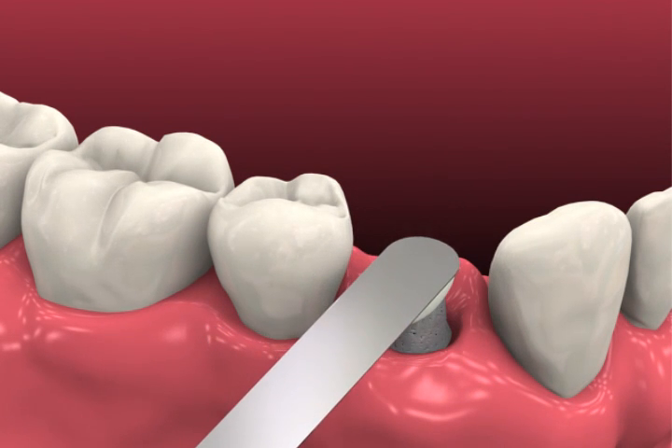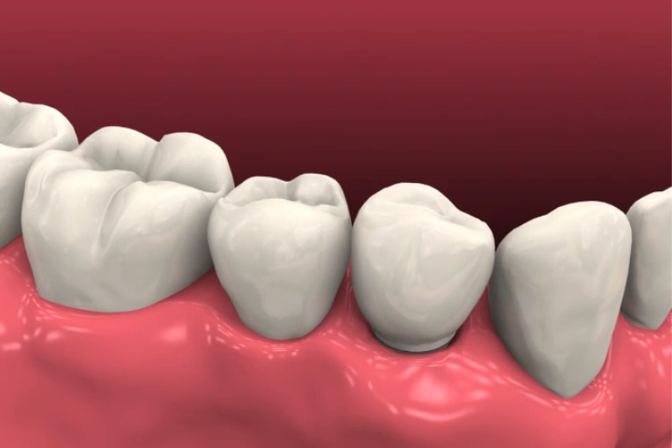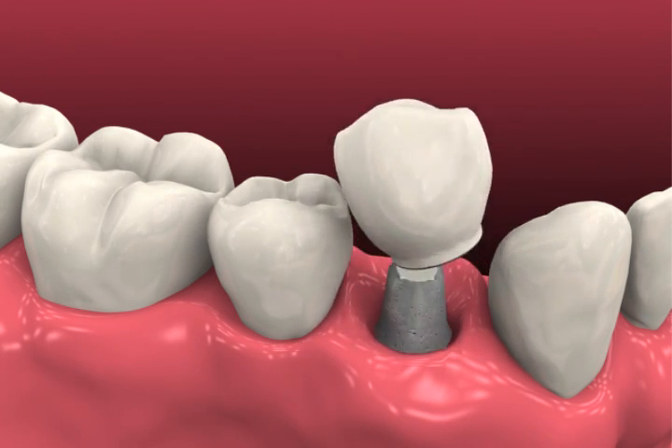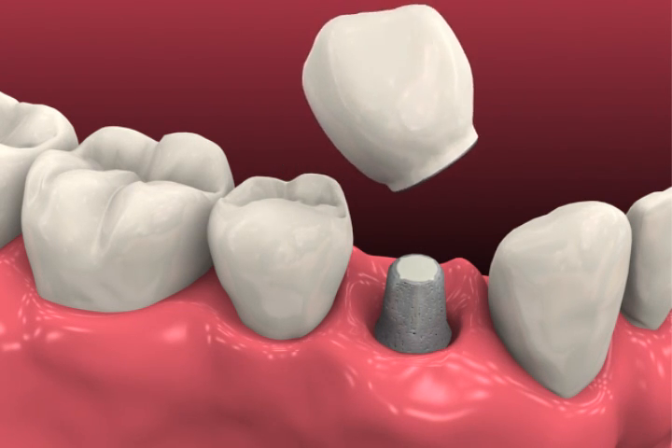Fill the screw access channel with a resilient material to prevent the ingress of cement. Seat the prosthesis and confirm fit and contour. Check occlusion and modify if necessary. Line the inside margin of the prosthesis with a thin layer of soft access cement.